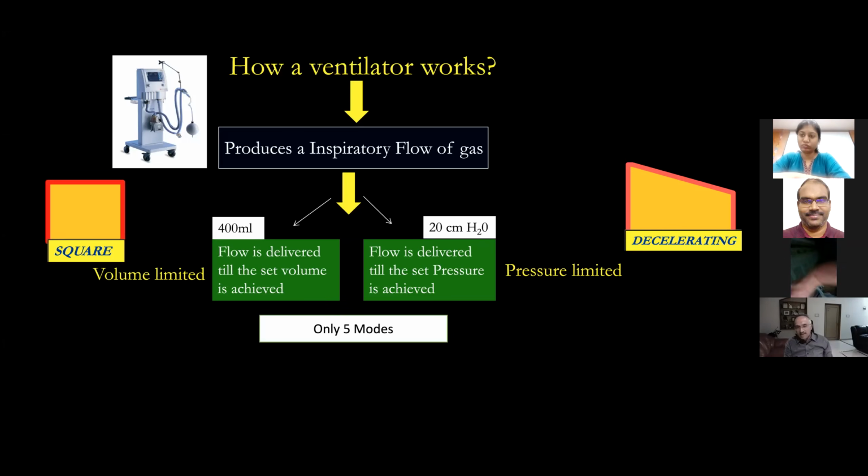Now, another thing I have added is that the ventilator is capable of producing only 5 modes. You remember this, only 5 modes. And all the newer modes are based on only these 5 modes.